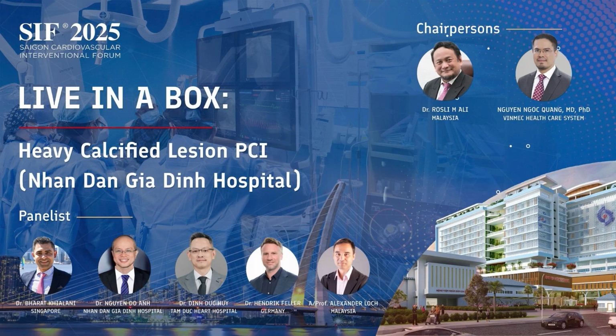Yeah, so I would like to ask our panelist, Dr. Takashi. You already presented a very nice case. So in this situation, what kind of imaging do you choose and how do you do the PCI? Okay, thank you. So in this case, left main is a problem.